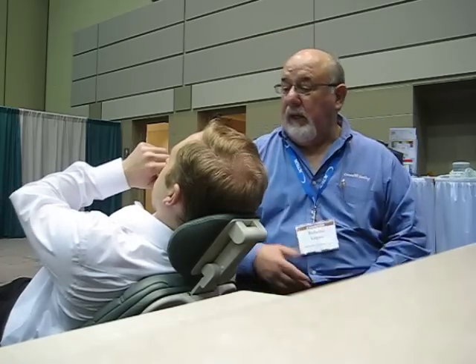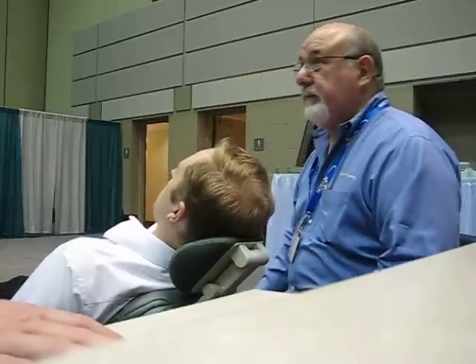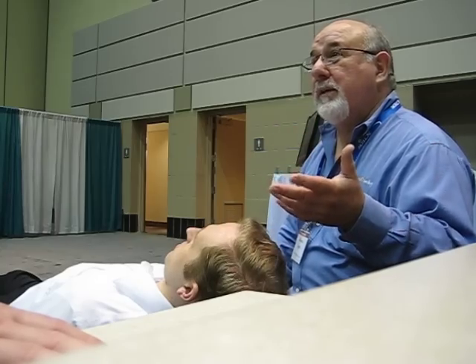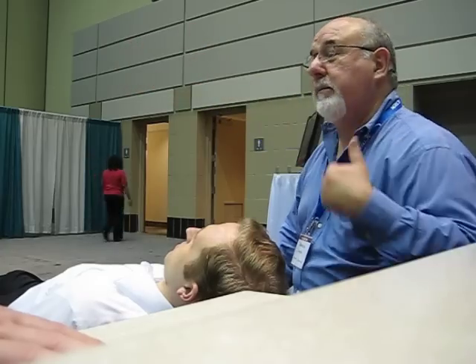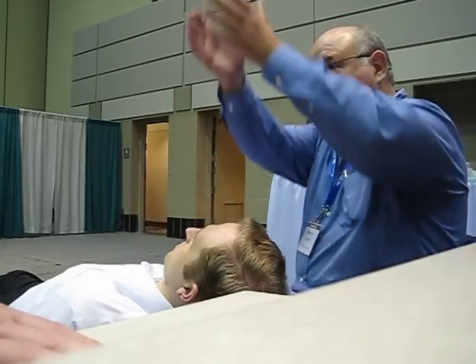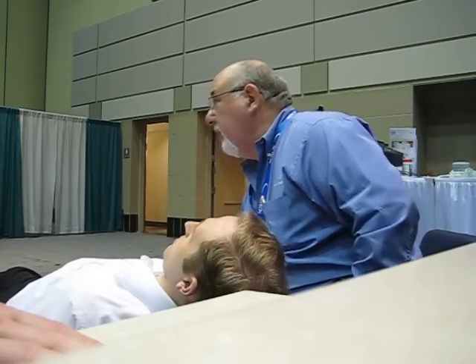In other words, the patient's going to come down low, so I can say, "Hi, Mr. Lopez, how are you? How's everything going?" Blah, blah, blah. Now I'm going to go and work on the lower arch. Now the important thing that you have to notice is that none of us have moved. The relationship of the oral cavity to the support cabinetry, to you, to me, everything is exactly, we haven't moved at all. This is in a plane all the time, so now I'm going to work on the upper arch.